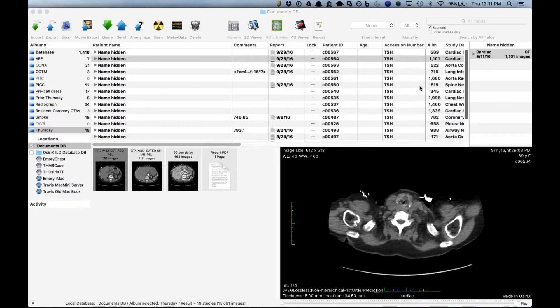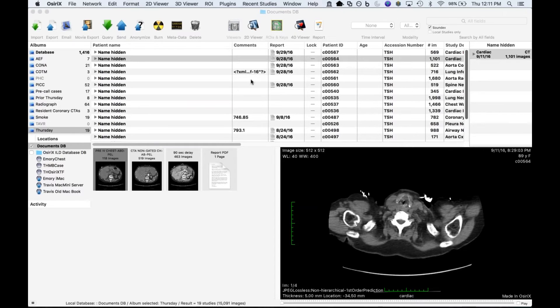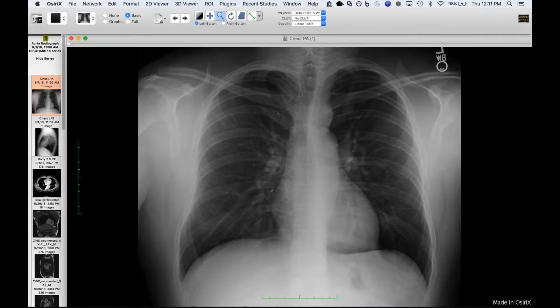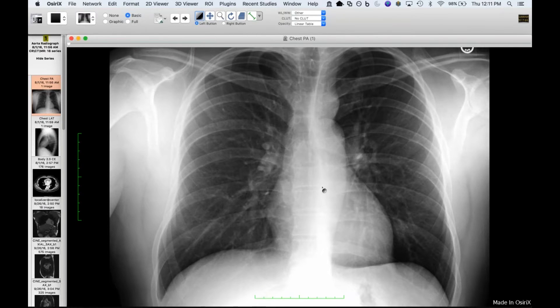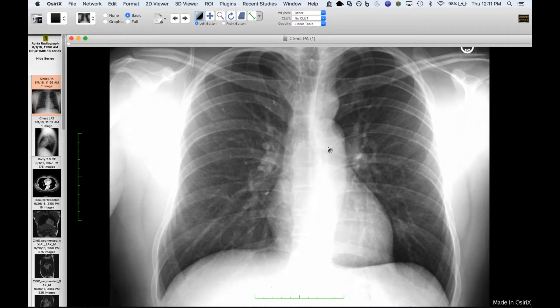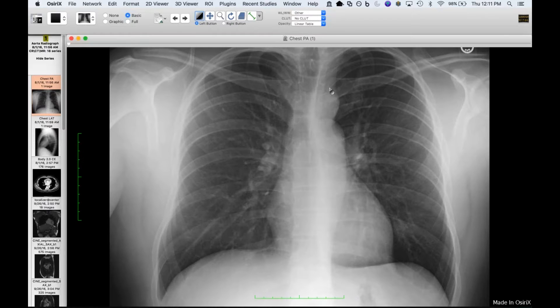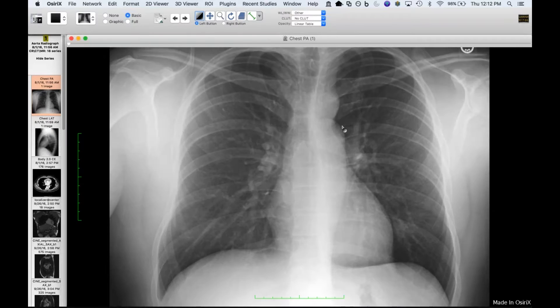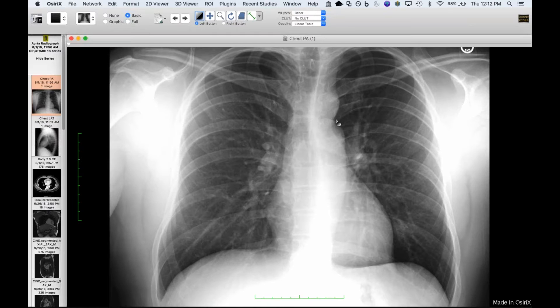This is the best example of this sign on a radiograph that I've ever seen. This was reported as an abnormal left paratracheal mass, which prompted a CT at an outside hospital. I think they presumed this was the aorta and that this was a mass. The only problem with this being the aorta is that it's too low and it essentially projects over the pulmonary artery — you can see the aorticopulmonary stripe right in here. Howard, I heard you had a pretty immediate reaction — I'm wondering if you're thinking what I think you're thinking.